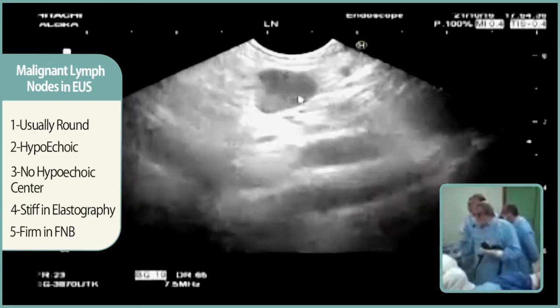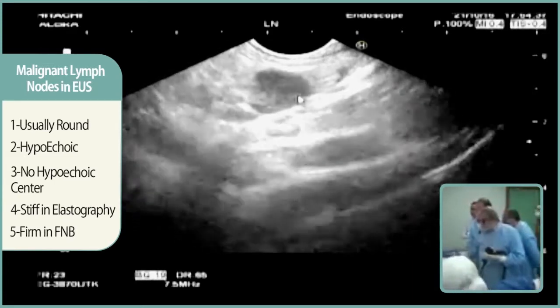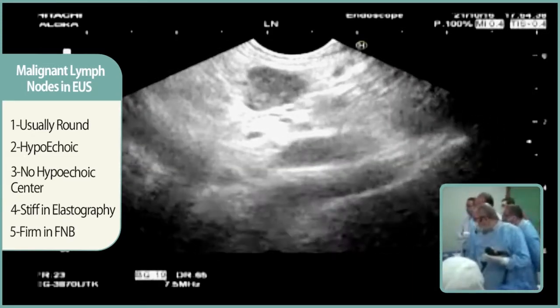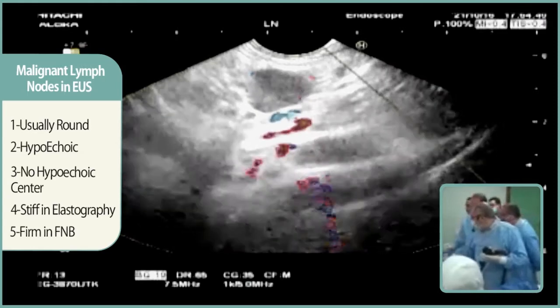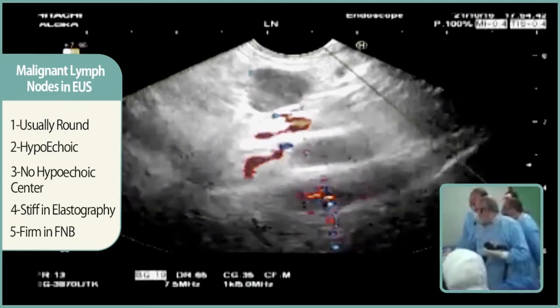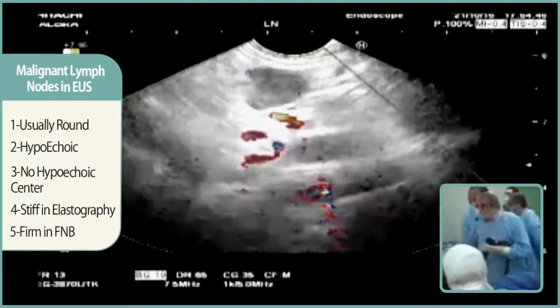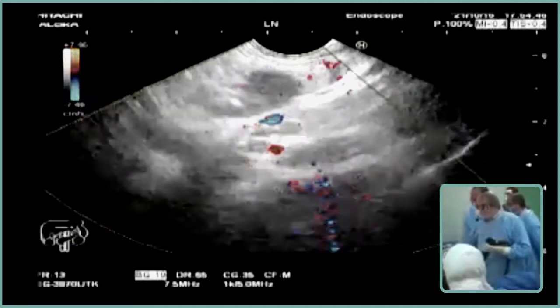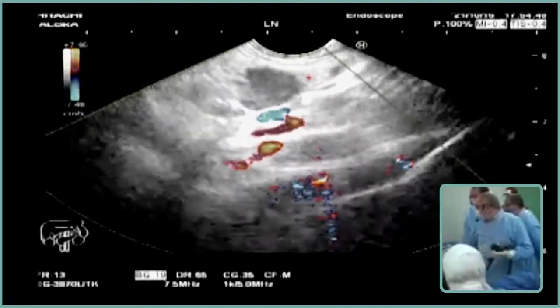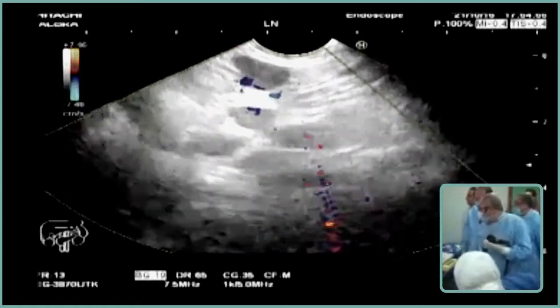It is hypoechoic — black — globular, with loss of the hyperechoic hilum. The normal hyperechoic hilum is no longer there, it is lost, so it is mostly a malignant lymph node. Although it is not large, there are multiple lymph nodes.